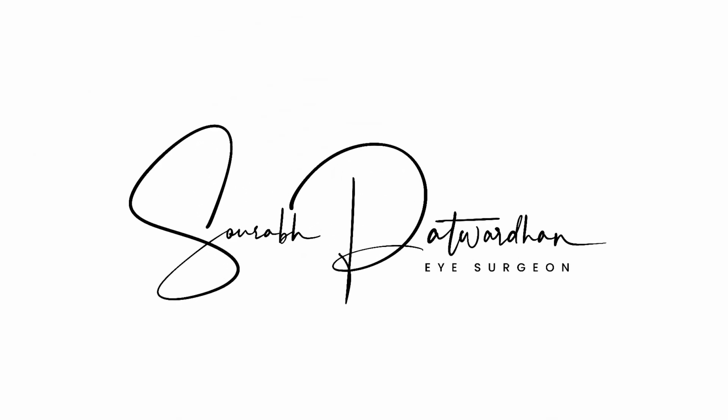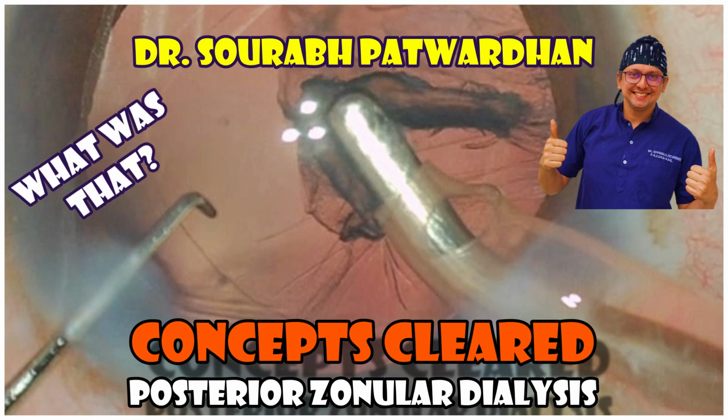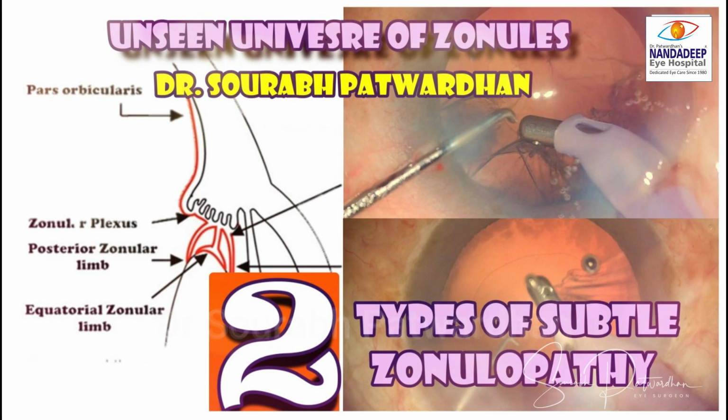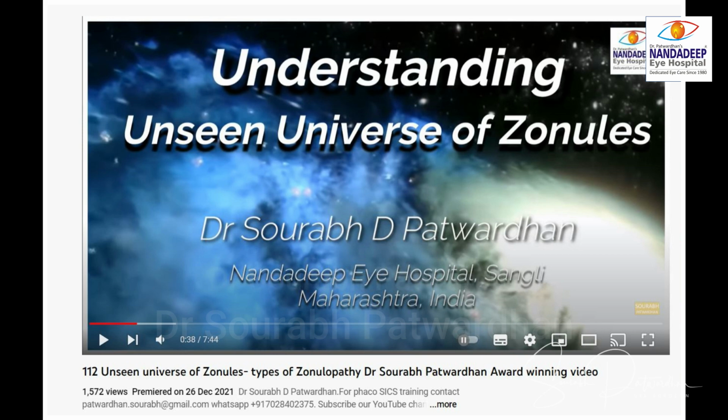This is a very interesting video which I am sharing now and will clear a few concepts regarding posterior zonular dialysis. I have already posted and described two types of subtle zonulopathy in a video I posted last year, and you must see it if you have not seen it: Unseen Universe of Zonules.